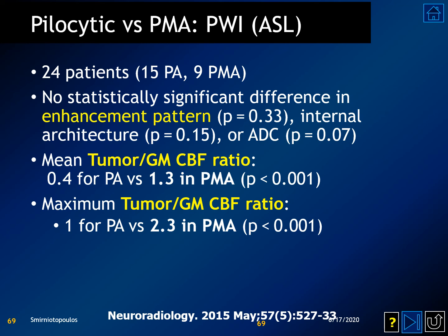PMAs also may have increased relative cerebral blood flow, especially in comparison to pilocytic astrocytoma, and this can be used as a differential feature preoperatively.